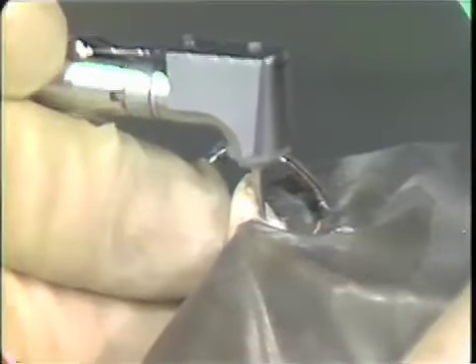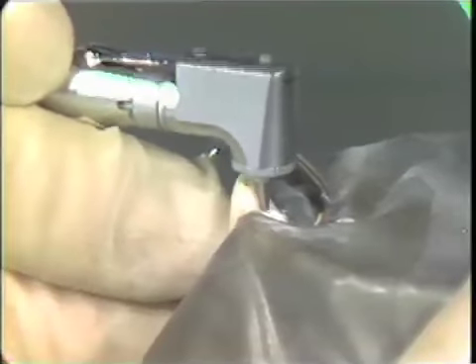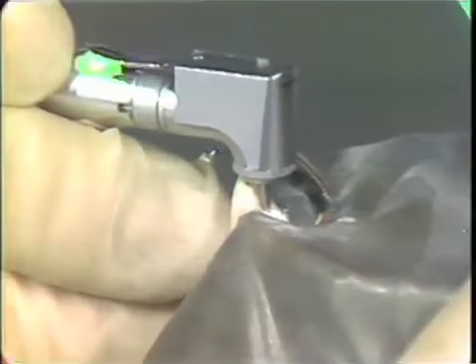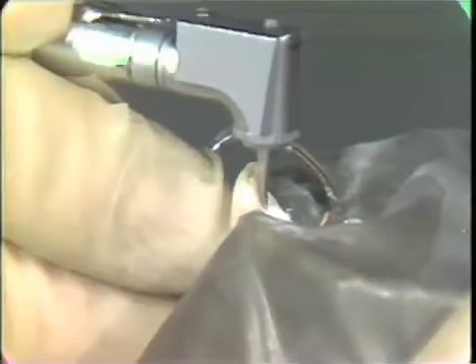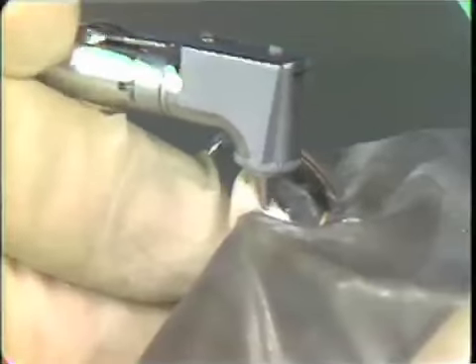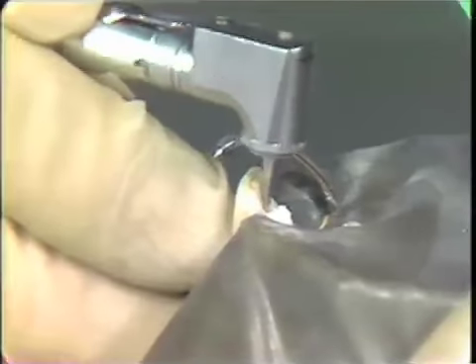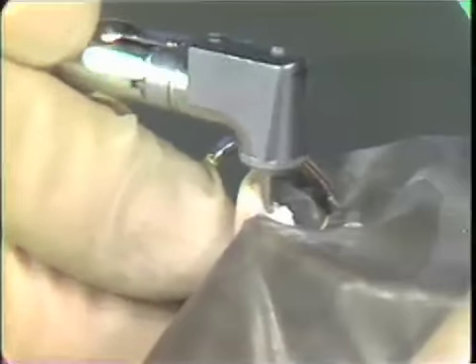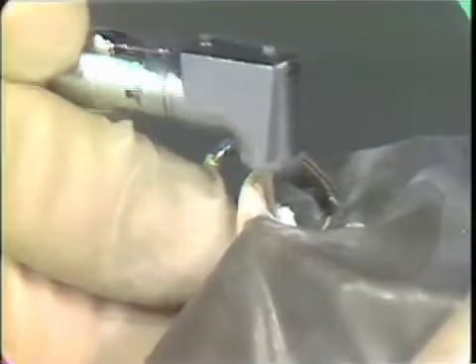Working from the inside out, I go against the mesial, the distal, the buccal, and the lingual unroofing. I go back and check and see if I can go from the inside to the outside without feeling any roof.